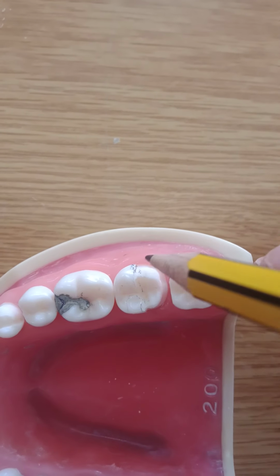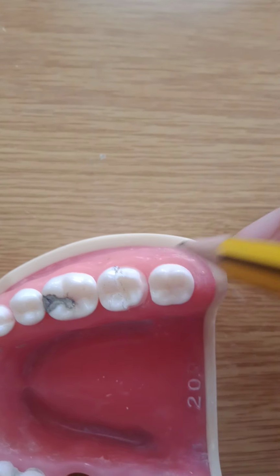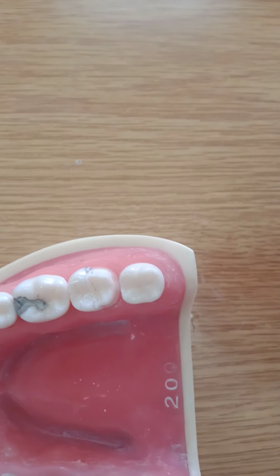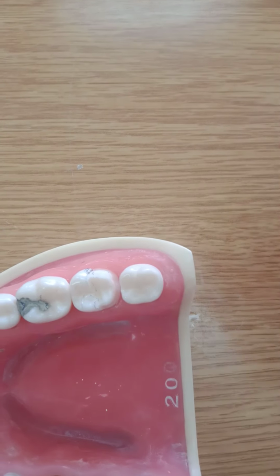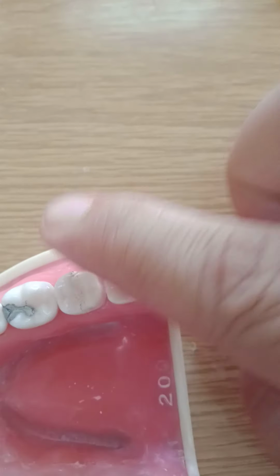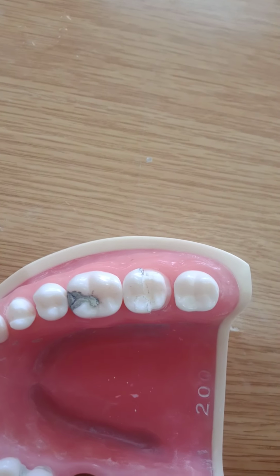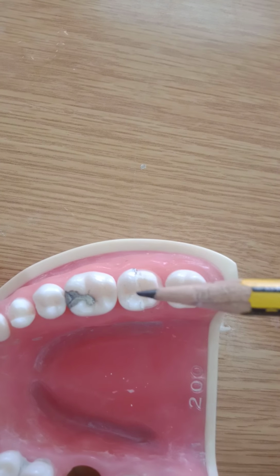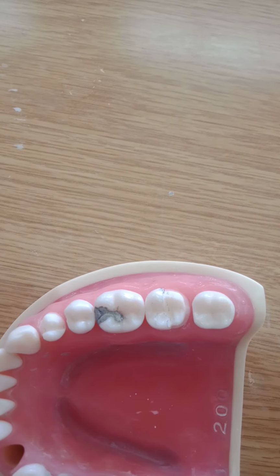So try to tilt your bur in a way that you do a very slight taper, because one of the differences I forgot to tell you about is that the taper in partial crowns is minimal. It's not like full crowns. You make the surfaces as parallel as possible. But here you don't have them parallel, you have undercuts. I could not see the finish line all together from one occlusal view, because the view I'm going down with the camera is the same as the path of insertion.